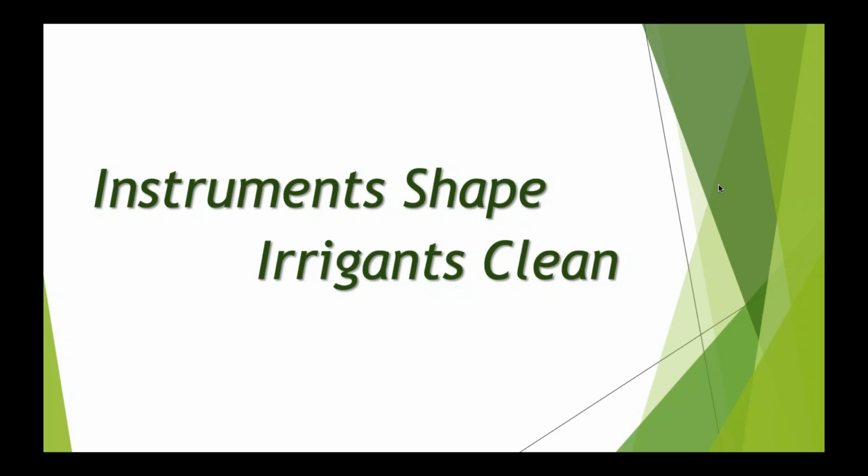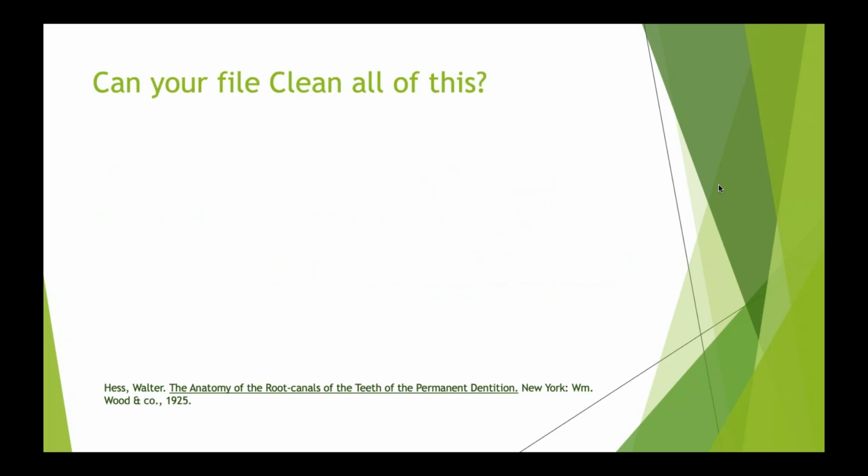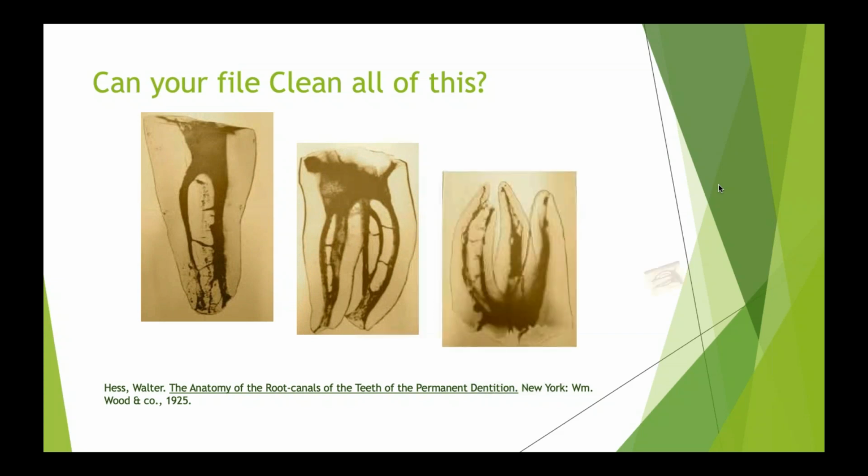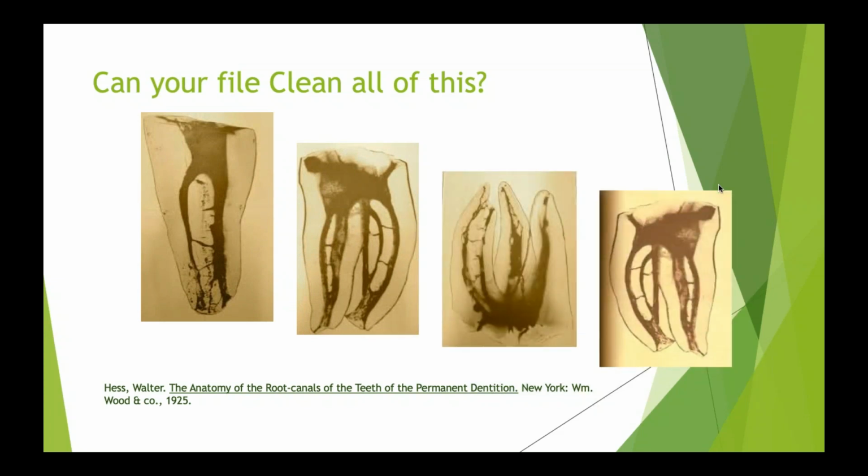But in endodontics, sometimes we don't spend enough time on how we really clean the canal itself, because you can create any type of shape you would like with rotary instrumentation. But the whole key is you still have to clean it, and that takes an irrigation protocol to clean the inside of the canals. If you look at the canals, there's so much to a canal system.